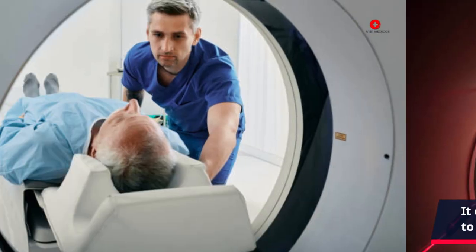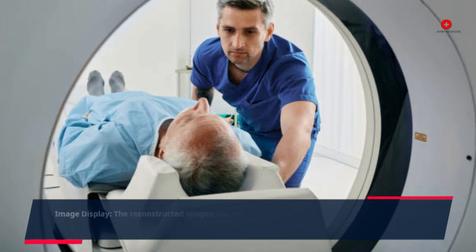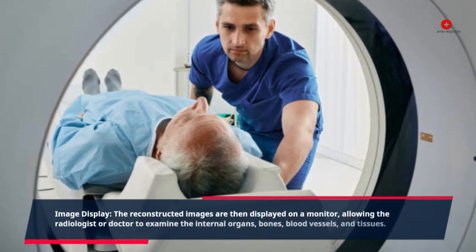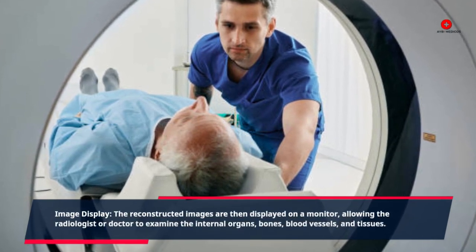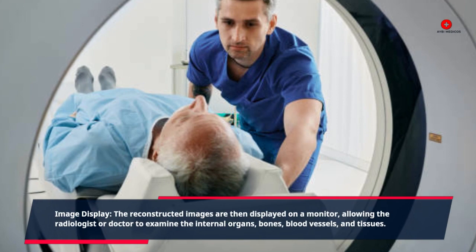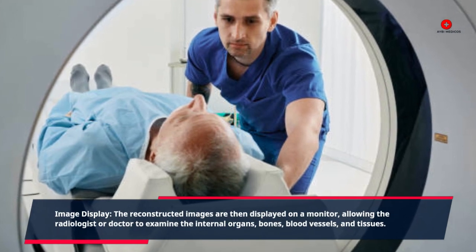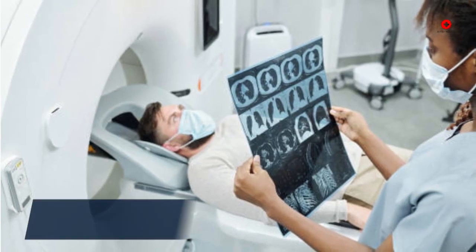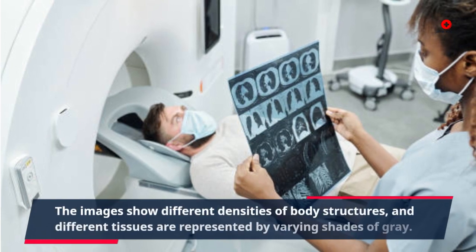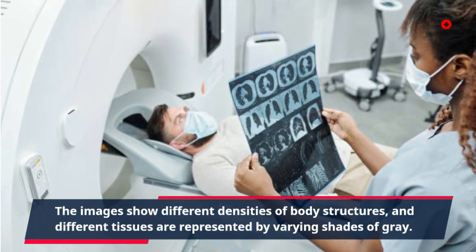Image display: the reconstructed images are then displayed on a monitor, allowing the radiologist or doctor to examine the internal organs, bones, blood vessels, and tissues. The images show different densities of body structures, and different tissues are represented by varying shades of gray.